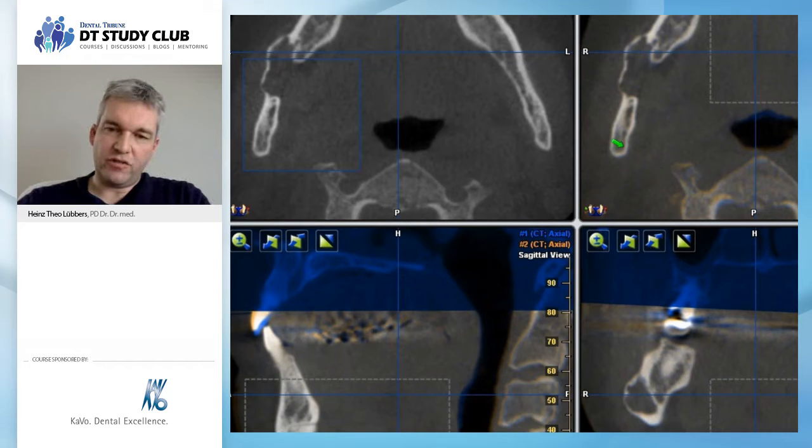So the registration of the 3D data was made at the mandible, of course, and then the vertebra was not in the exact same spot. Same here with the upper jaw. The upper incisors are not in the exact same spot, because on the blue picture here the mouth was closed, on the orange one it was a little bit open. And I would expect something like that in this cyst area too, if there was any type of change in the cyst.